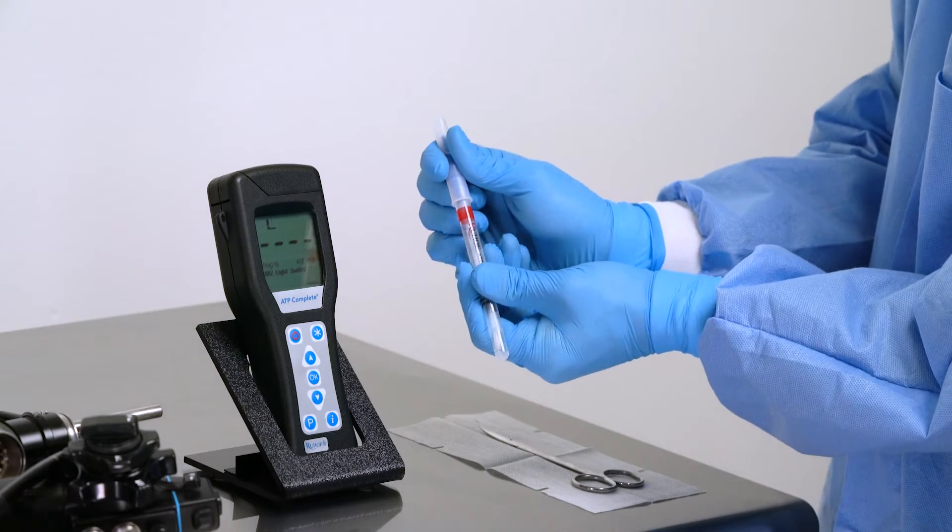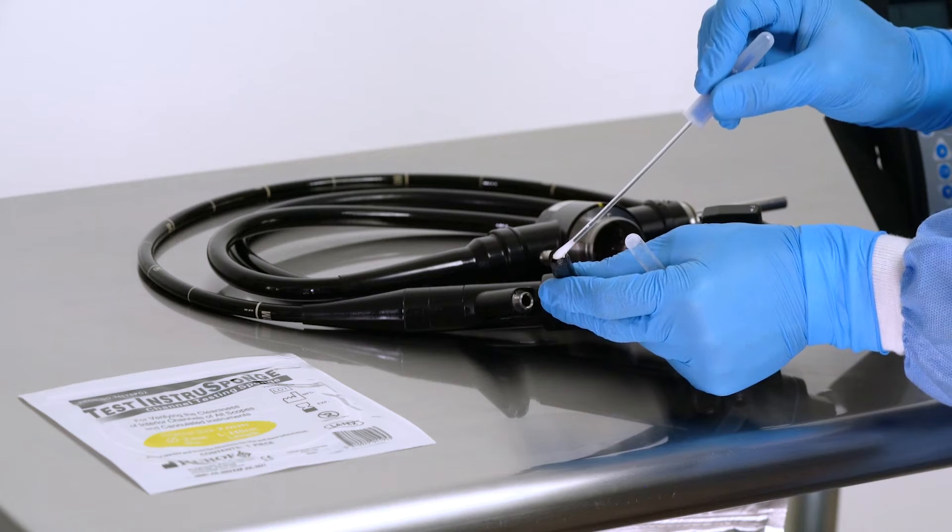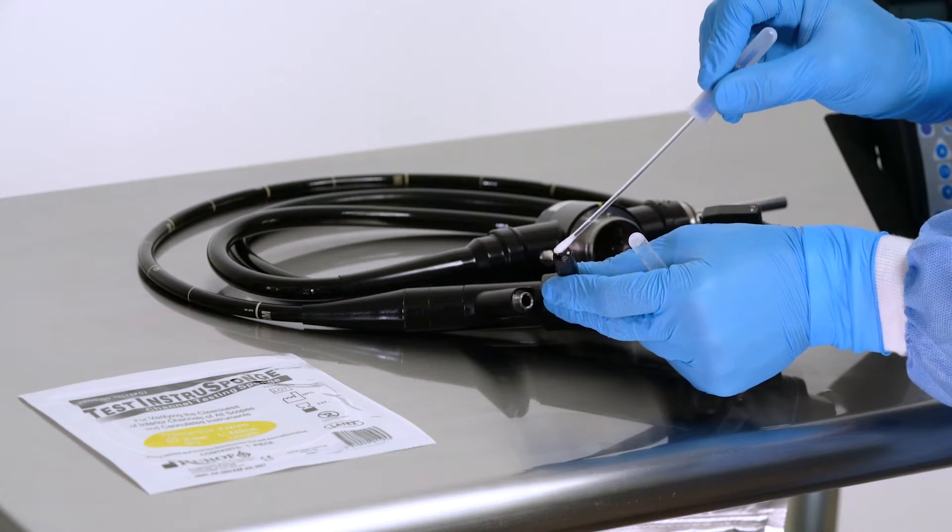Take the test swab out of the tube and swab the area of interest, such as the distal port and other critical ports of the scope.